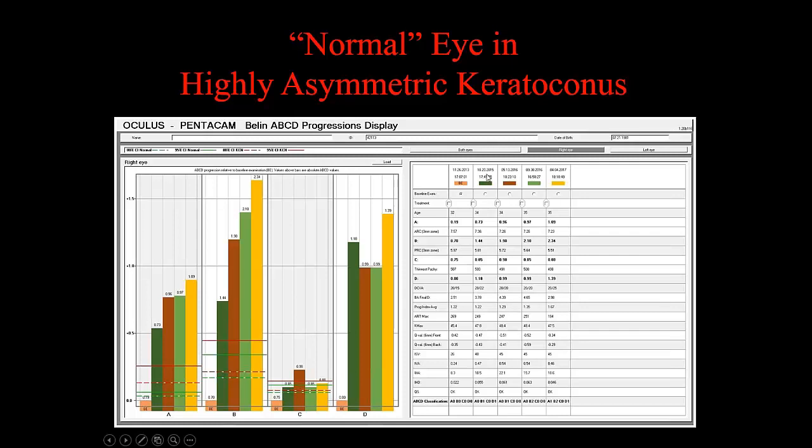But looking only at the anterior surface and not having, again, tomographic parameters to determine progression, their treatment was delayed till 2017. It was still caught early, but they already had decreased vision. This example alone should really speak to the importance of carefully following the patients tomographically, and determining not when vision changes, but when statistically significant changes occur on any anatomical surface. Again, I think this is a great example of the value of the display.